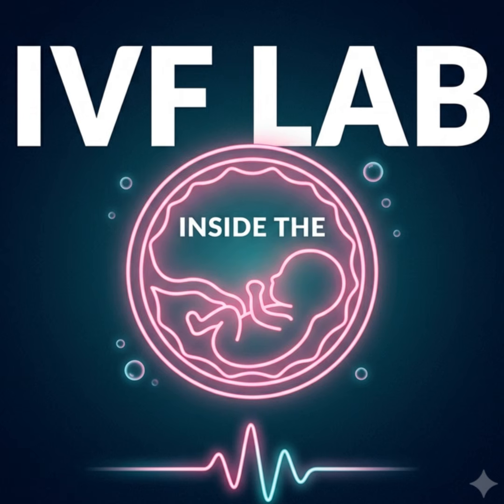And finally, we have the third pillar, gas consistency. Many modern incubators use a low oxygen environment, usually around 5% oxygen. This mimics the naturally low oxygen tension inside the female reproductive tract. The ambient air in the laboratory, however, is 20% oxygen. Which seems like a good thing, right? We need oxygen to live.